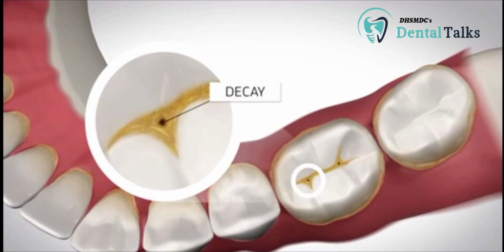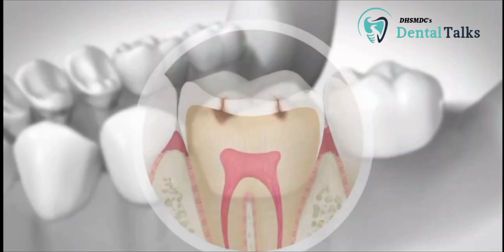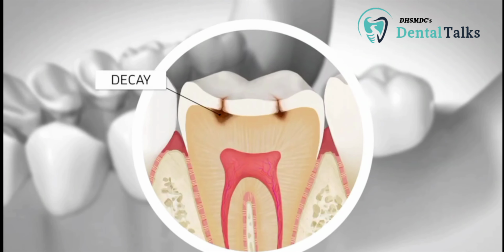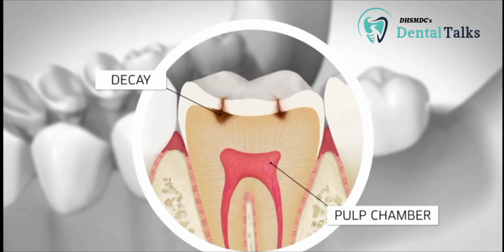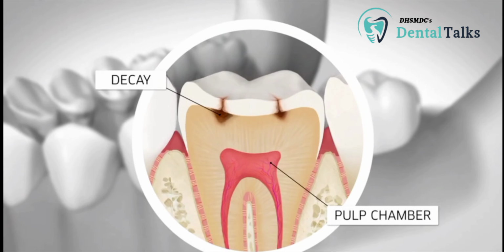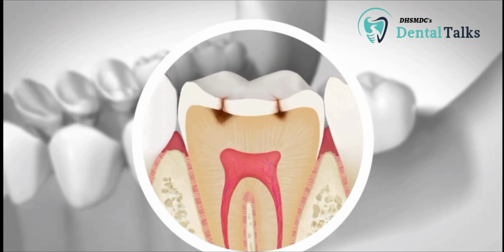In this example, you can see that the decay has been detected early. It is through the tooth's enamel and into the dentin layer, but not all the way to the pulp chamber. For this slight amount of decay, a filling can be used to restore your tooth.